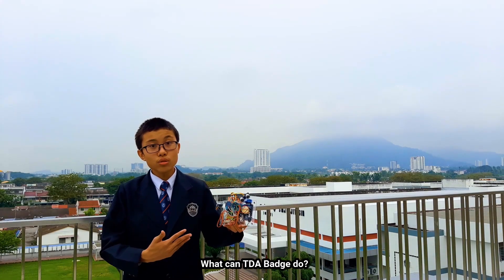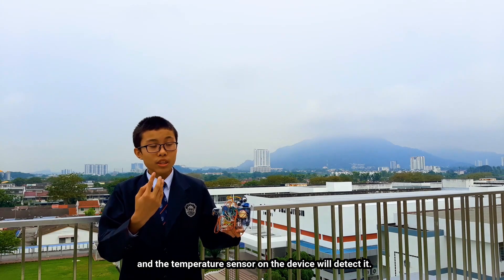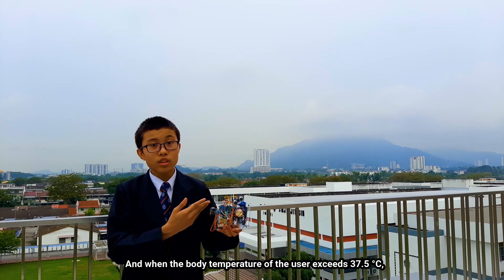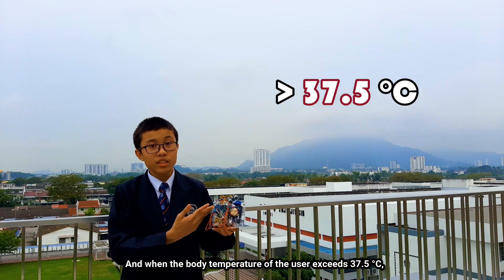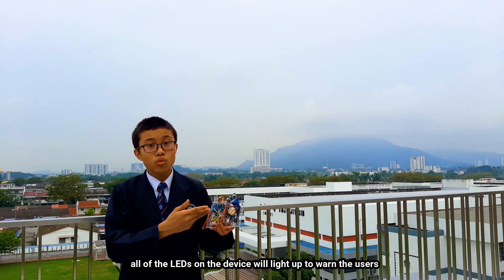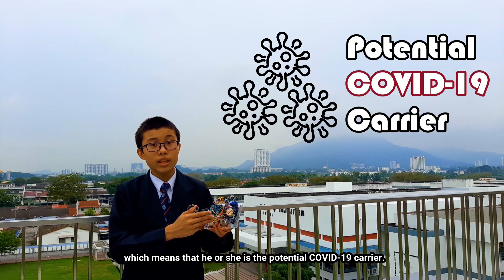Number one: the TDA Badge can detect the body temperature of the user using its temperature sensor. When the body temperature of the user exceeds 37.5 degrees Celsius, all of the LEDs on the device will light up to warn the user, indicating that he or she is a potential COVID-19 carrier.